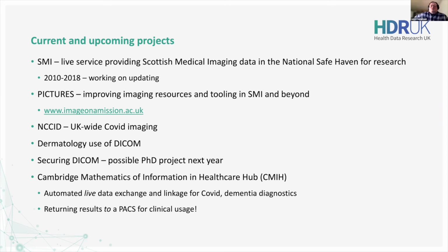DICOM is, I would say, in an earlier stage of this at the moment, partly because these systems are very isolated from the general internet, there hasn't been as much work yet on all the nasty things that could be done with a DICOM file. But we are starting to look at that, possibly as a PhD project next year, going into Pictures.